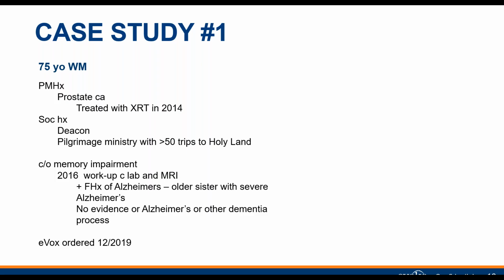Actually, I got into EVOX simply because my patients were living a long time, and they all start worrying about getting Alzheimer's, and so I needed a test to help me figure out if they're going to get Alzheimer's because mom had it and stuff. But anyway, when we ran across this blue brain, I've been playing with a supplement called Neo 40, which is a nitric oxide supplement, and have had some interesting results. And these are just three of them.